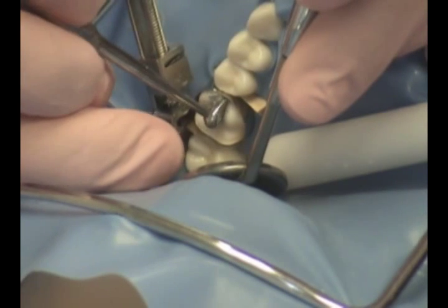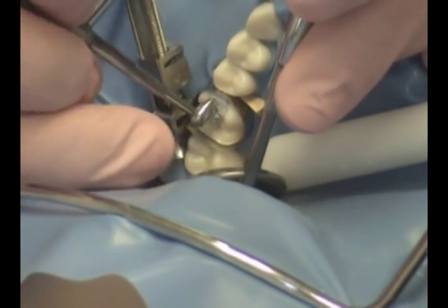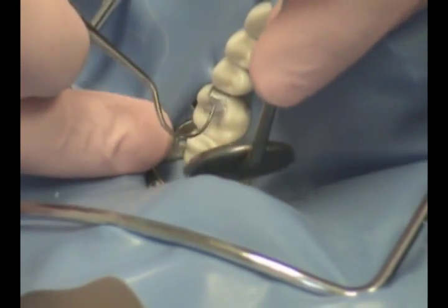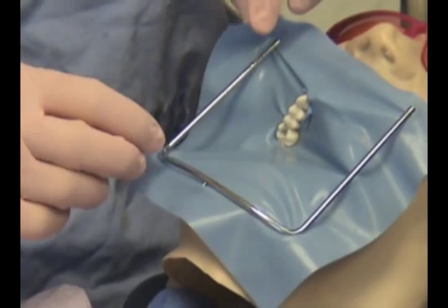Once the preparation is filled, the amalgam will now be carved. Various instruments are used during carving. Once the initial carving is done, the wedge and matrix band are removed. Any additional carving is now continued. Once the carving is completed, the rubber dam clamp will be removed.